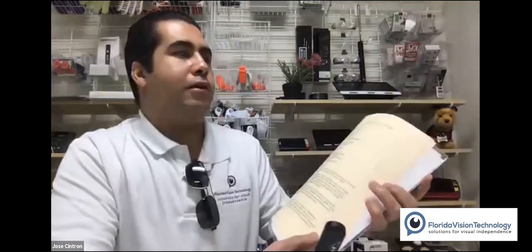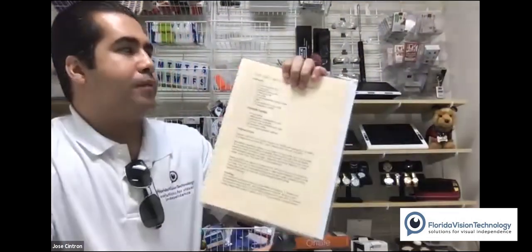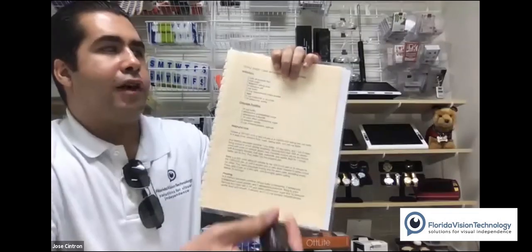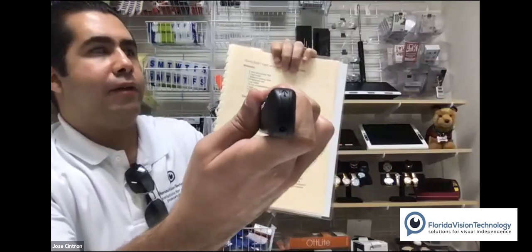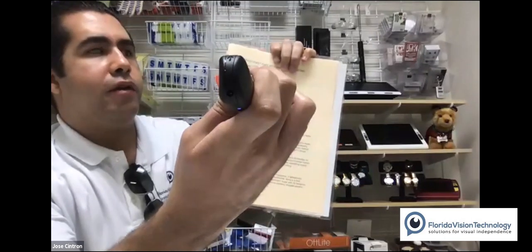Jose, I have a question here. Someone was unable to see you use the laser. Would you be able to demo that for them again? Yeah, so let me try to do a little closer to the camera. Okay, so right now you see the recipe, yeah? Yes. So I'm just gonna take a regular picture, right? Single tap that trigger button real quick. Pick it up. Okay, let's press it.